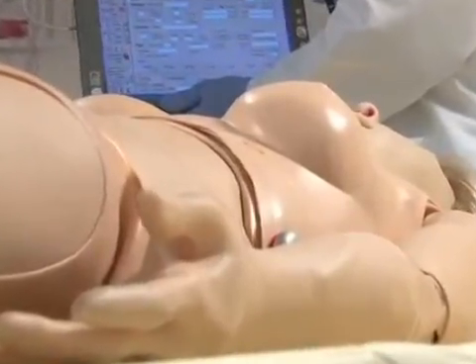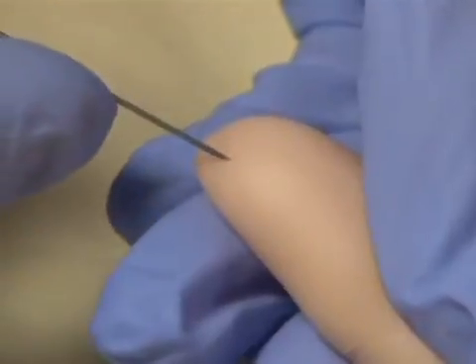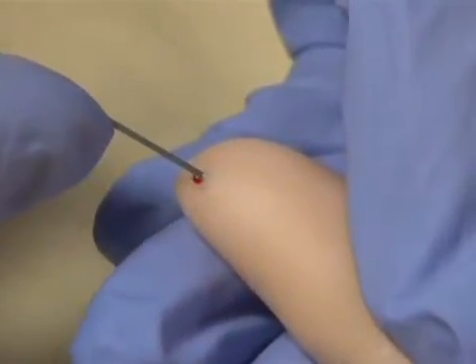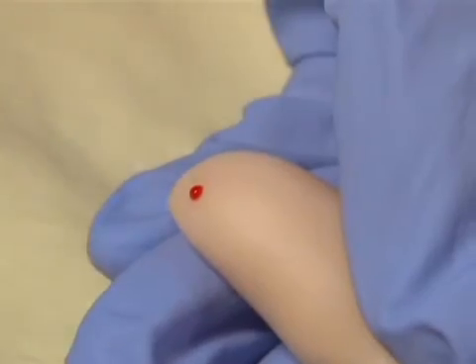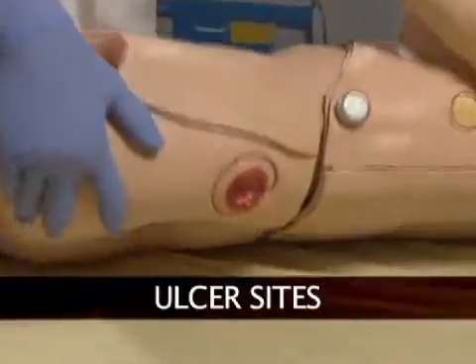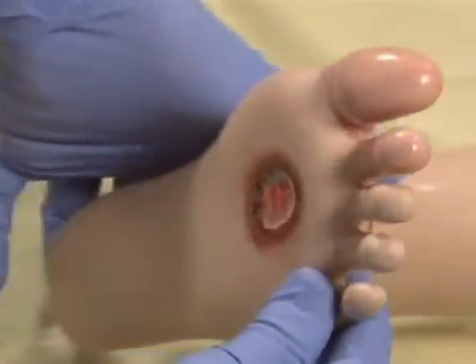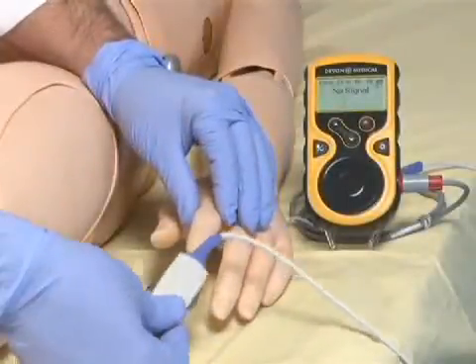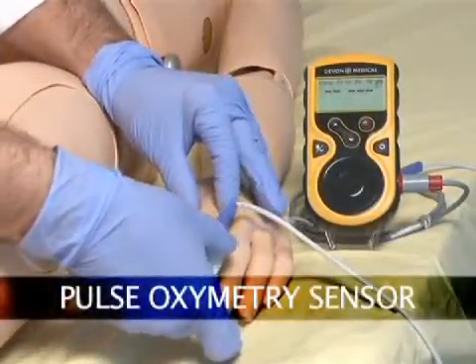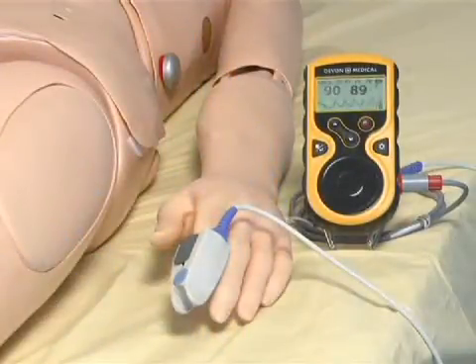There are intensities to choose from. Providers can perform finger stick and draw samples of simulated blood, treat decubitus ulcers and an ulcerated foot. SUSI also features a pulse oximetry sensor within the forefinger of each hand, allowing providers to attach commercially available pulse oximetry devices and determine SUSI's oxygen saturation.